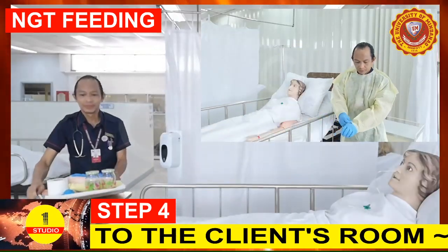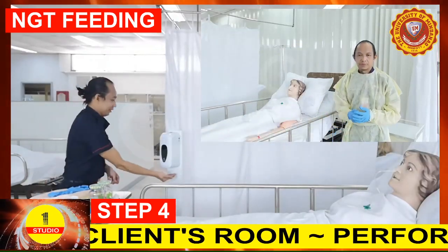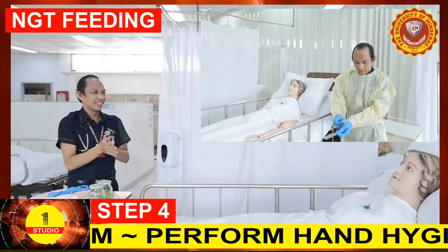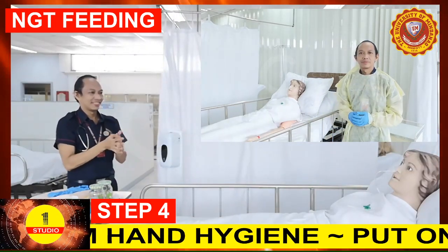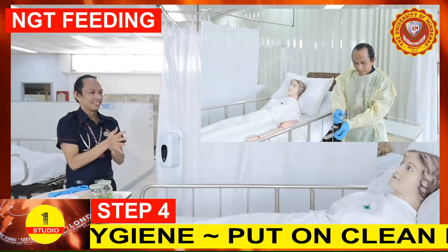Step 4. Go to the client's room. Perform hand hygiene with 70% alcohol-based hand gel. Put on a pair of clean procedure gloves. Wear a plastic apron or a gown.